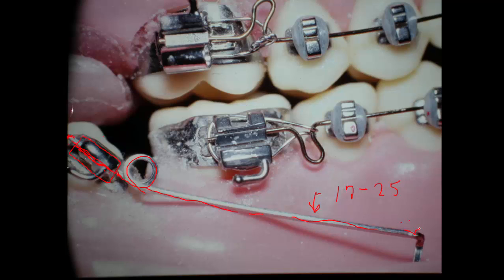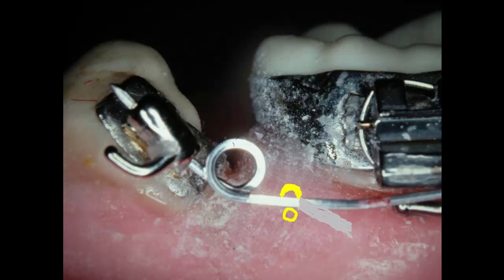Now you raise this leg of the spring up and mark it where you're going to put this little hook. And so we pick this up, put a mark, we take it out of the mouth now, and bend this hook over and turn it back in. You see, now we can slide it back into the slot again, then raise this up and hook it over this, and it'll have a kind of a little bow in it like that. When you do that, maybe we'll show that in the next one. So we picked it up and put it in.